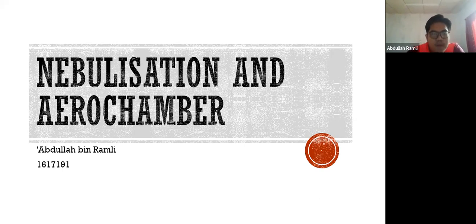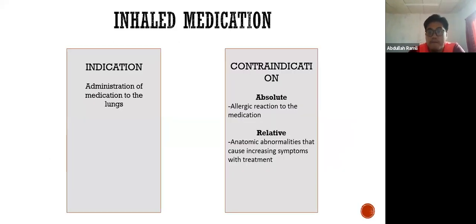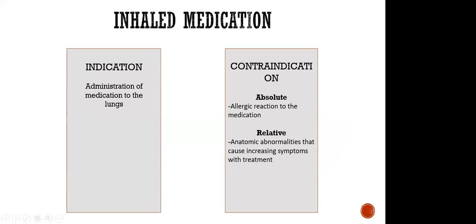So, okay, I'm going to continue with last week's questions about nebulization and aero chamber. Okay, next slide, please. So nebulization and aero chamber. It's basically used for inhaled medication, right?